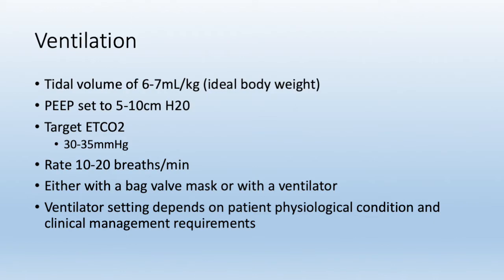So things to think about, bag valve mask is relatively straightforward and simple. You connect it, you squeeze it, but you're going to have difficulty in trying to get the exact tidal volume, and also your respiratory rate can be quite difficult as well. And you lose a clinician, and it can be quite dangerous in the back of a moving car.